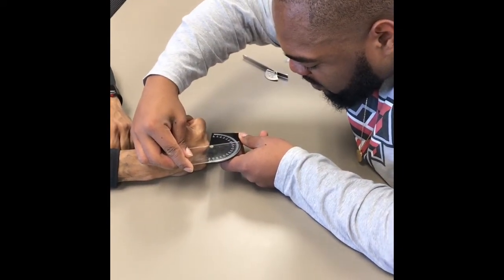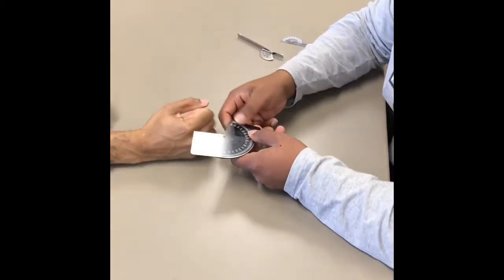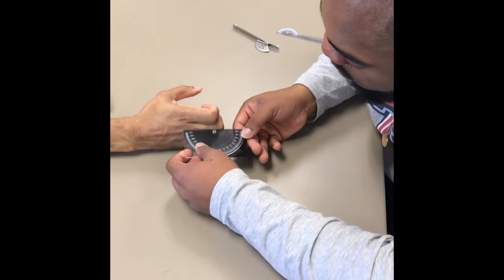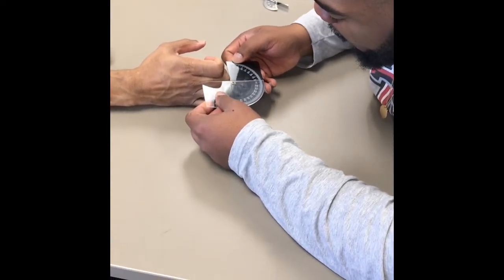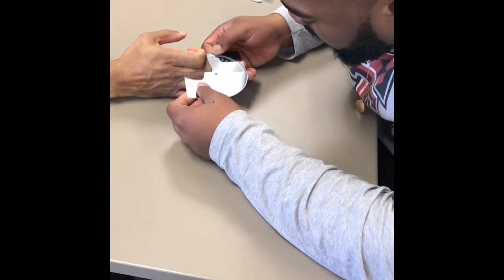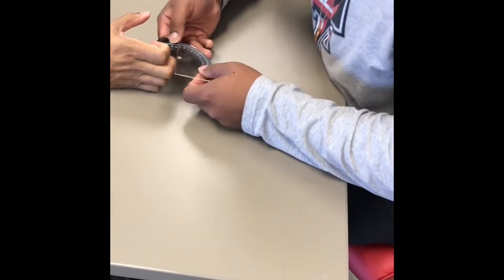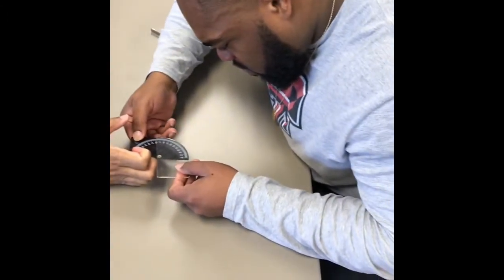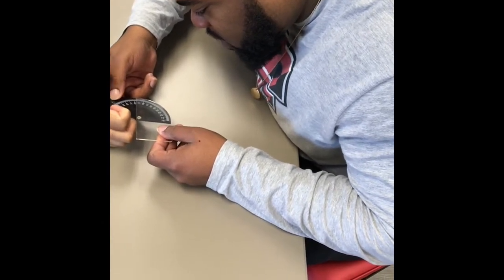For the MCP, he is at 75. For the PIP, he is at 97. And the DIP is at 90 exactly.